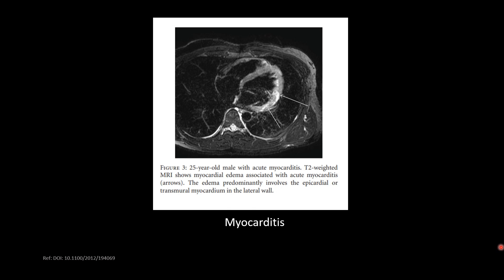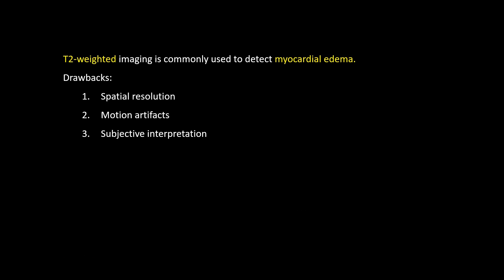Here is a case of myocarditis — you can see significant edema in the lateral wall of the left ventricle. However, conventional T2 images have certain drawbacks: spatial resolution is not that good, they are very prone to motion artifacts, and interpretation is subjective because the data is not quantified. To quantify the T2 data, we do T2 mapping, which we will talk about next.